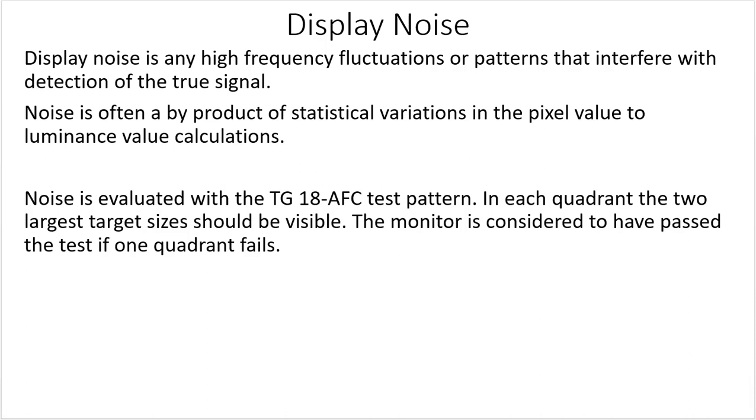Noise is evaluated with the TG18AFC test pattern. In each quadrant, the two largest target sizes should be visible. We want to see big white dots. When I show you this, you're looking for big white dots. The monitor is considered to have passed the test if one quadrant fails. So there's 4 in a quadrant. 3, you're still good.